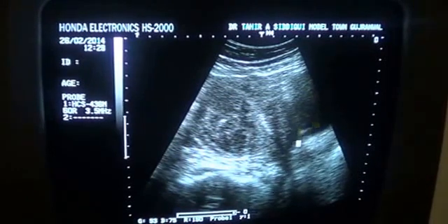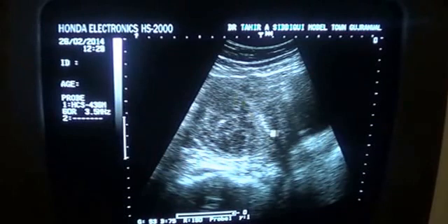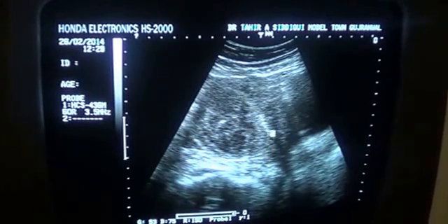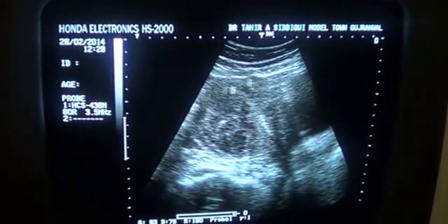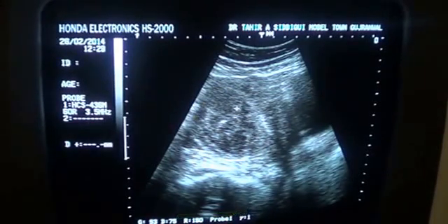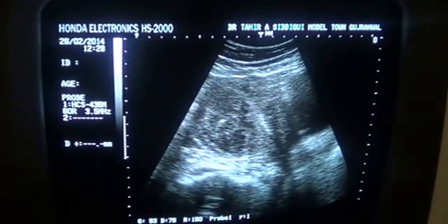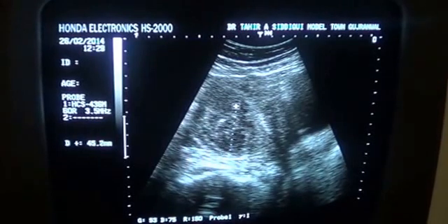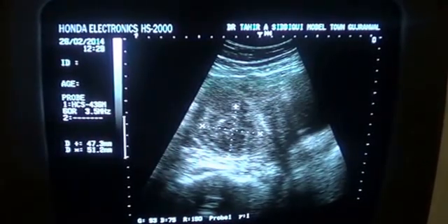This is the urinary bladder section. This is the anterior myometrium. This central echogenic line represents the endometrial canal. This is the fundus, and this heterogeneous area with internal tiny calcifications is myoma uteri.